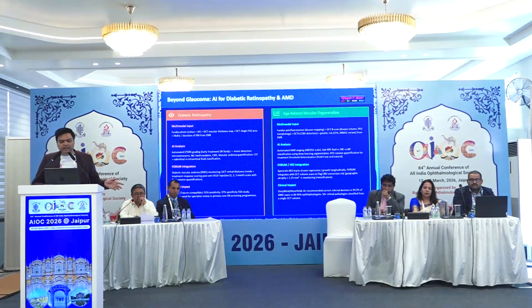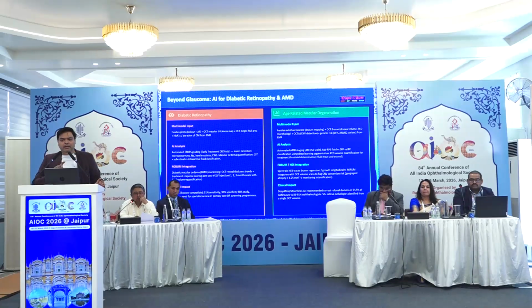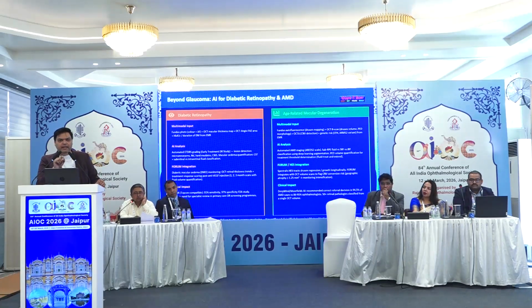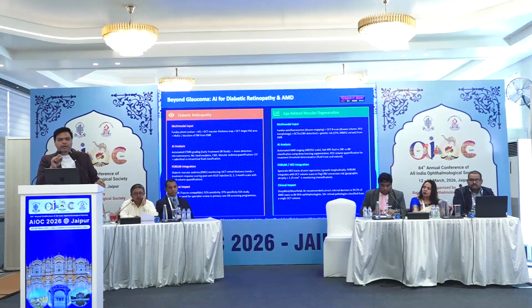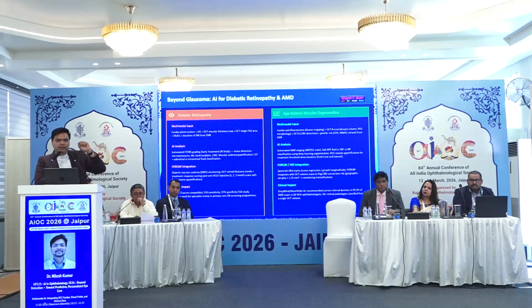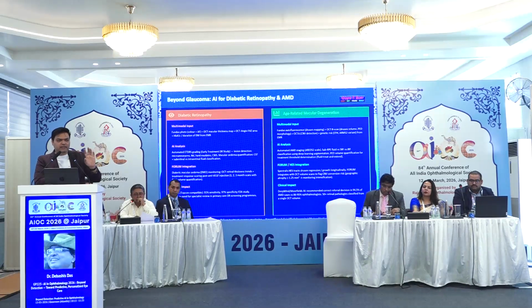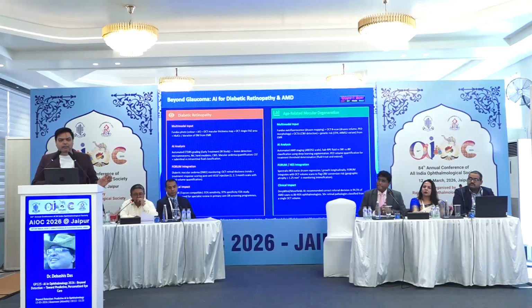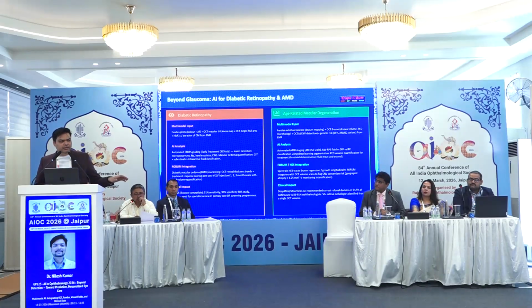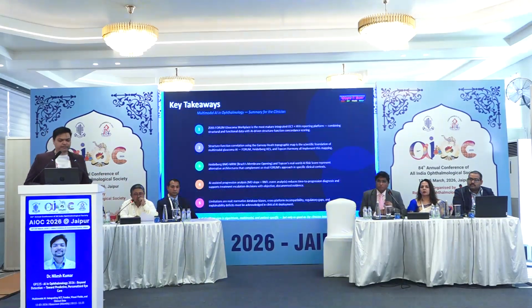And with that, they are also coming up with Pathfinder, in which they are integrating AI into the OCT, so that it will detect at which point. It scans the entire retina, but it will tell you at which point you have the disease. So you can just go to that point and see what the pathology is. They are not able to yet diagnose what it is, but they are able to localize that there is a subtle change in this area. You go and see what it is. With that, I'll just close my talk. Thank you.